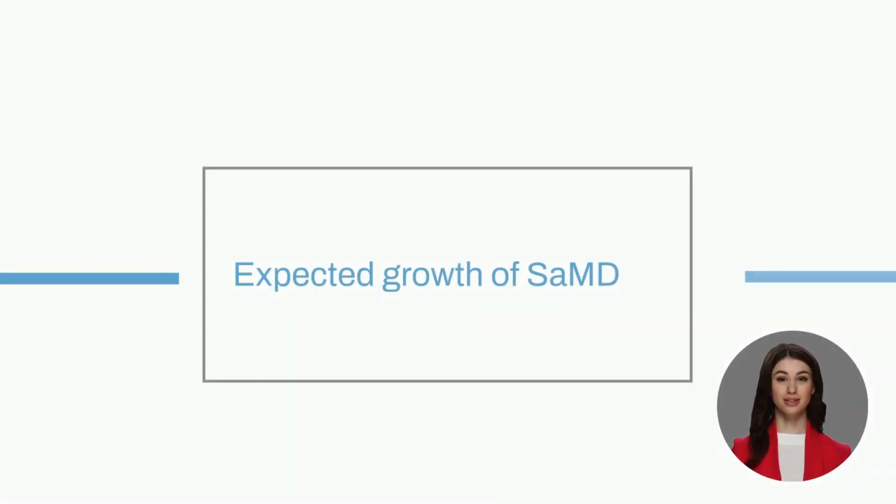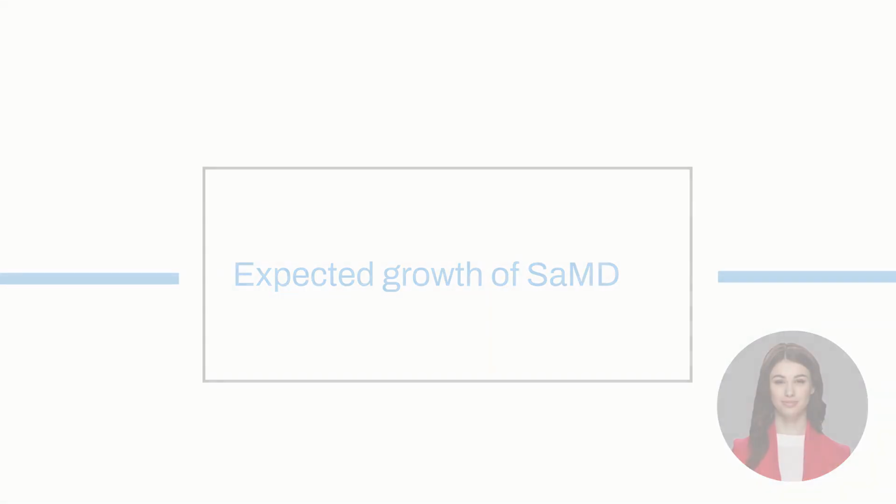SaMD's growth will accelerate, expanding at a CAGR of 25.6% from 2021 to 2028. Drivers include mHealth's acceptance, chronic illness prevalence, and demand for affordability. COVID-19 fueled this. SaMD is convenient for remote care due to its ability to monitor patients remotely. Technological advancements and patient-centered care demands will also fuel growth. Regulatory barriers and data privacy concerns are obstacles.